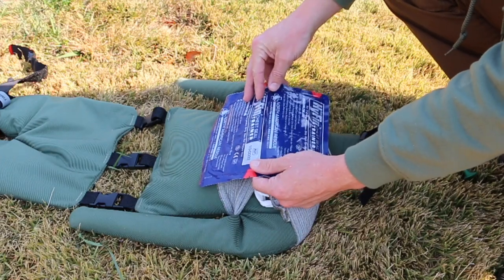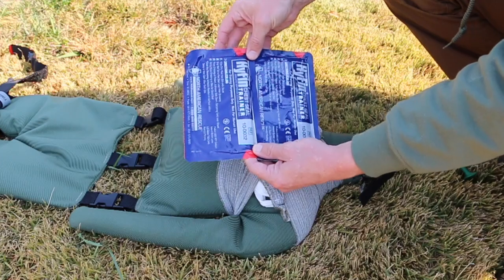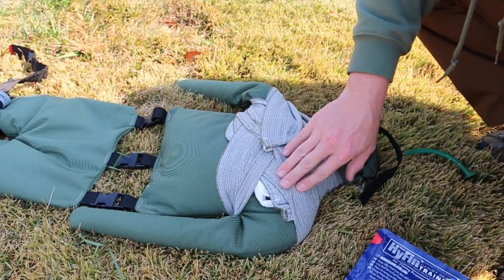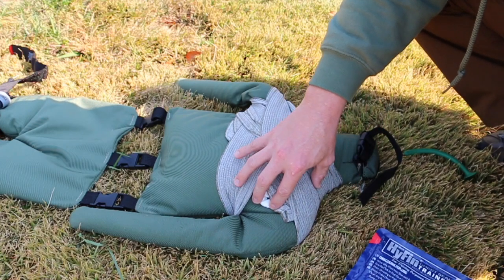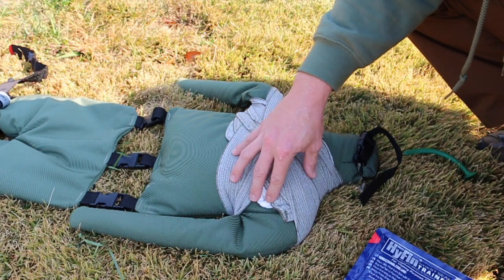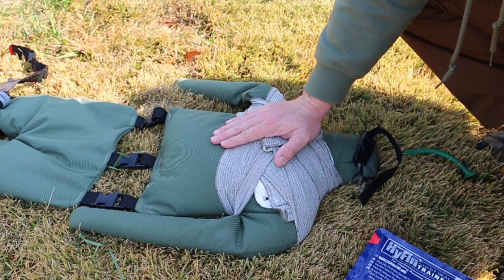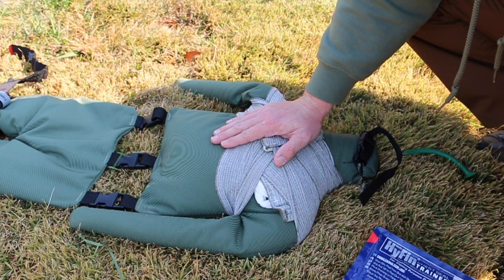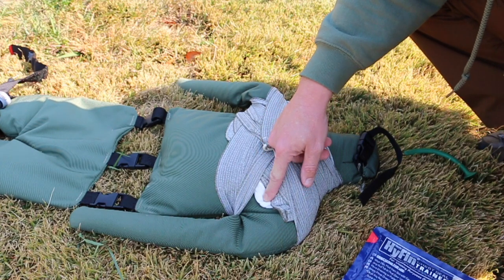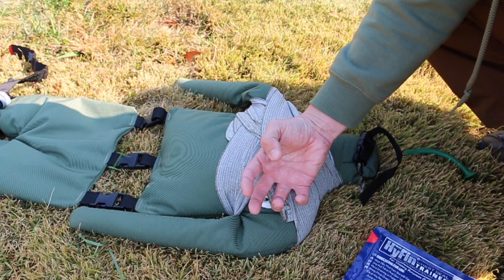These normally do come in a dual pack here, so you get an entry and an exit wound seal for our patient. Now, we do not wound pack the thoracic cavity here. How we wound pack this is just for the shoulder, okay? You're wound packing the shoulder muscle, things like that, because you're using the muscle as your cavity for your pocket. Once we start getting into the middle of the abdomen and the chest, you're just not going to do any good. You're just going to push things around and you're not going to actually push them against anything. We're pushing the artery up against a bone or muscle, things like that, to try to create that pocket, the cavity that we're going to use it for.